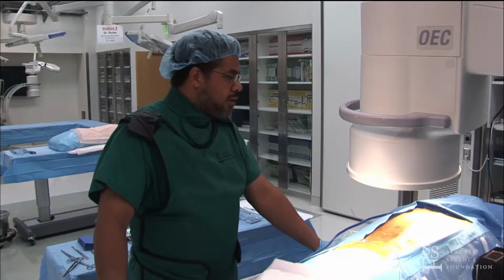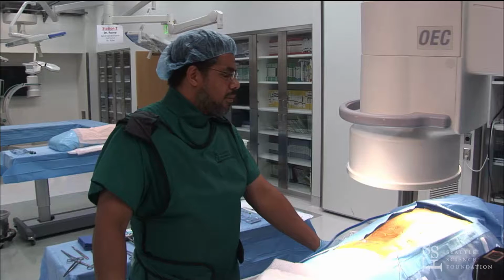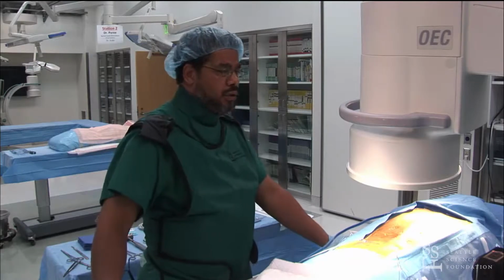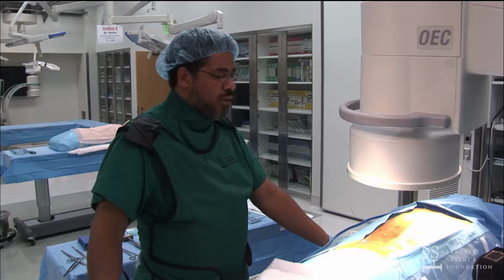With good amount of slack there, I haven't seen any migration. I think it's depending on the anchors you're using. Like I say, the anchors. If you compare it to the old spinal cord stim anchors, I would say it's certainly less. With the new spinal cord stim anchors, they're all pretty decent. And so I'm seeing very little migration with those as well. They might migrate a contact or two here or there.